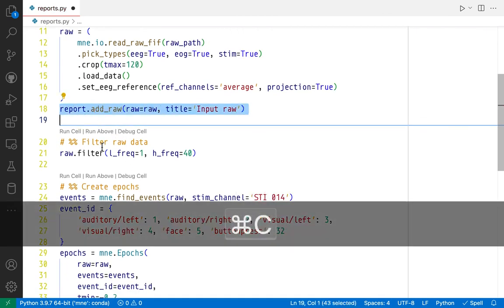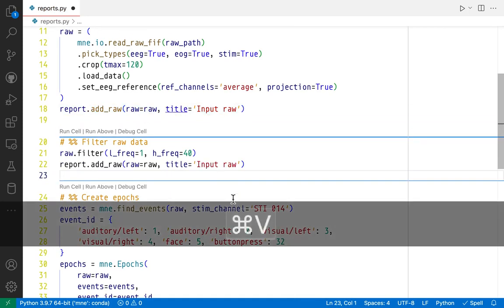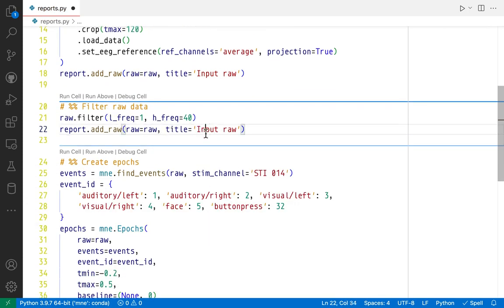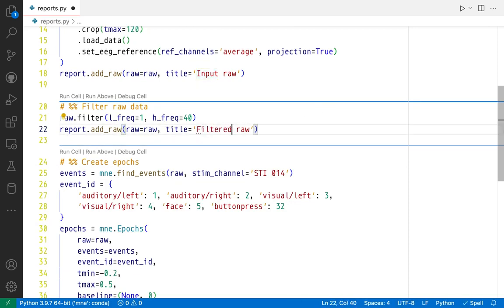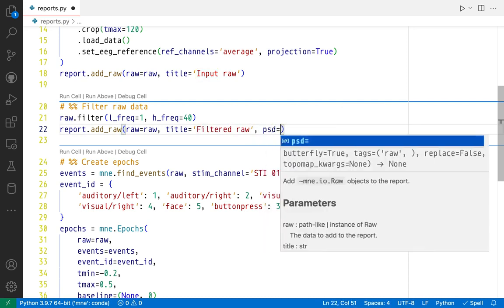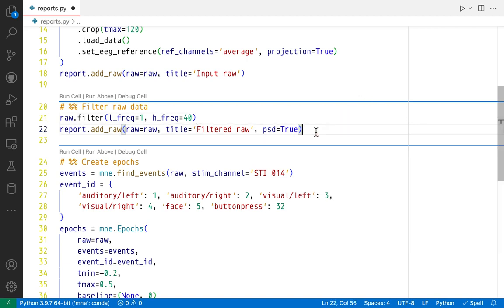Just going to copy and paste this line here to add the filtered raw data to the report as well. I'm just going to change the title, filtered raw. And because I want to see the effects of filtering, I'm also going to pass psd equals True, which will ensure that we will get a PSD visualization, a PSD plot in the report.